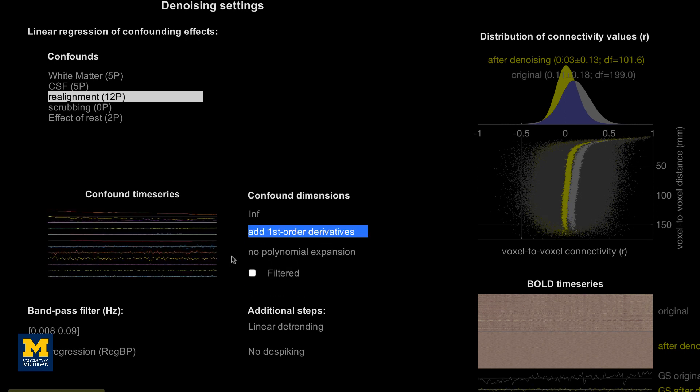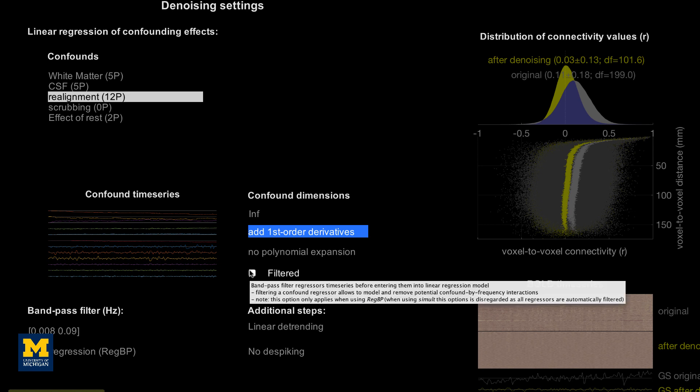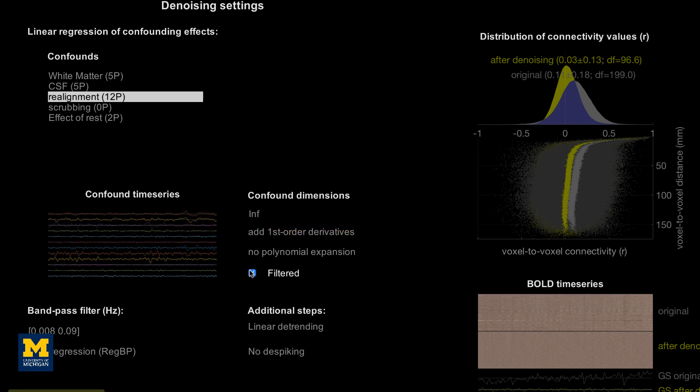The filter checkbox specifies whether the regressor should be bandpass filtered before it is entered into the model. You can do this for individual regressors by highlighting the confound regressor and checking the box, or by changing the after regression reg BP option to simultaneous. The reasons for choosing to do these are discussed more in the link to the book below.